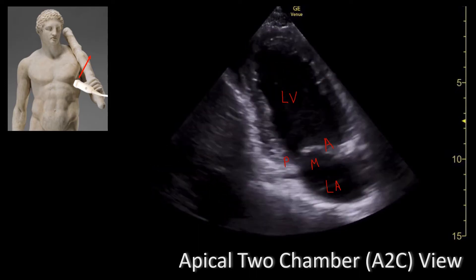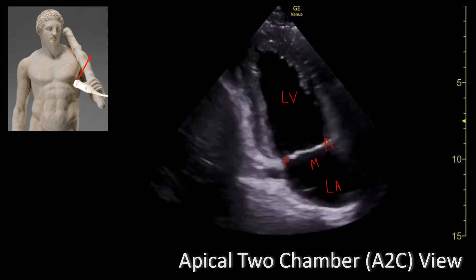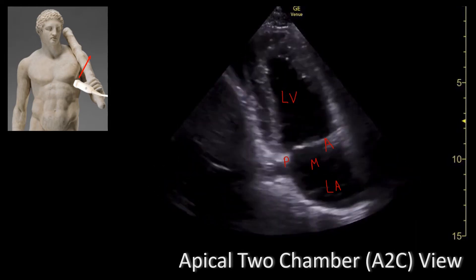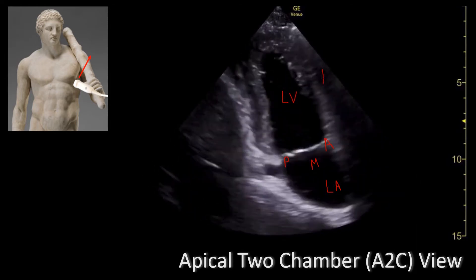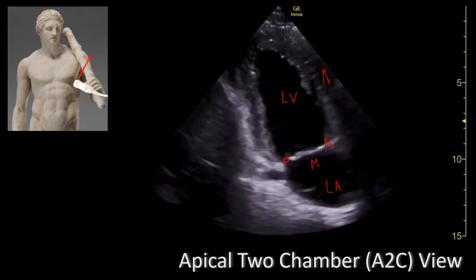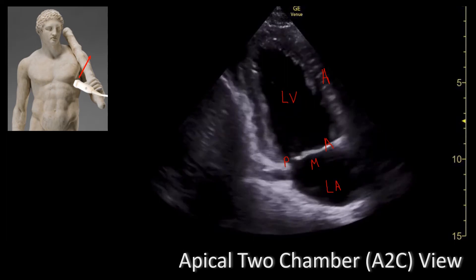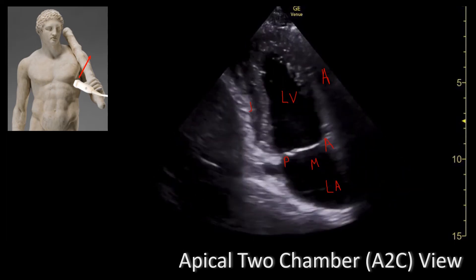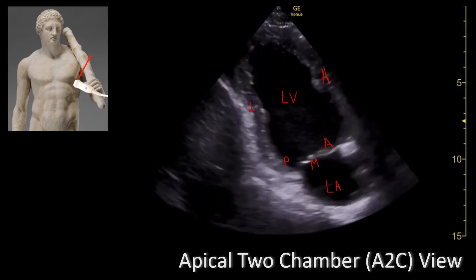Let's talk about the walls of the ventricle. On the right side of the image you have the anterior wall of the ventricle, and right opposite to it you have the inferior wall of the ventricle.